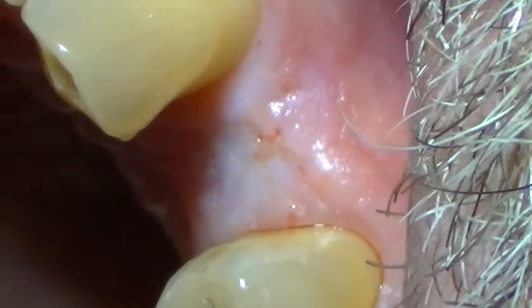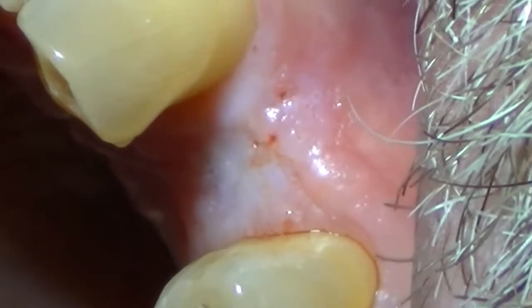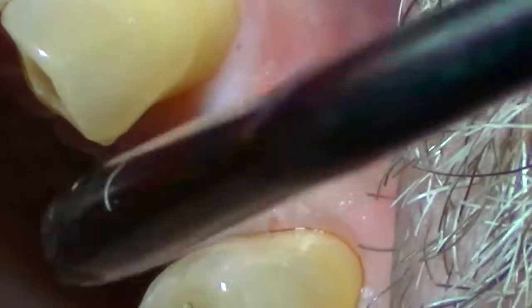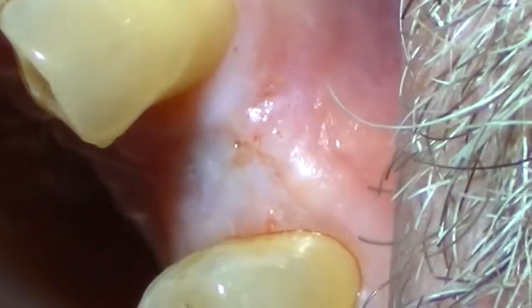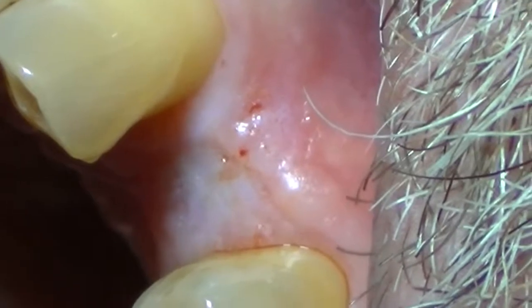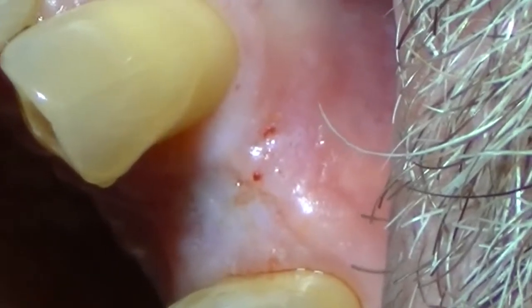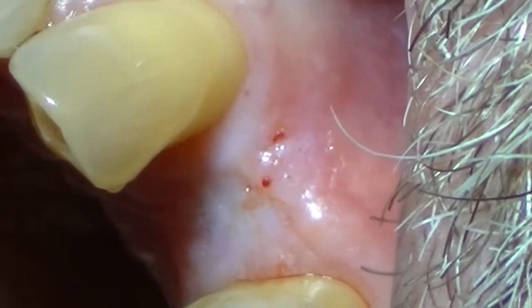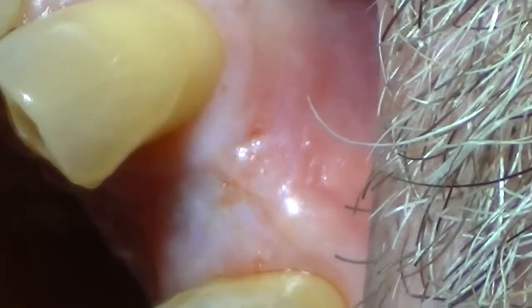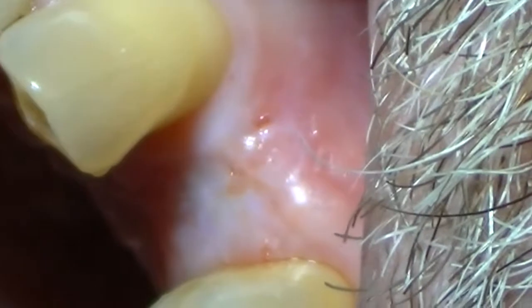We've already anesthetized the patient, but as we said before, we're always evaluating the amount of attached gingiva we have in this situation. Now, we talk about different protocols or techniques that we can use. We can use a flapless or a punch technique, or we can reflect the tissue. If you're not sure about a certain situation, then it's always better to reflect the tissue. So let's start with this edentulous space first.